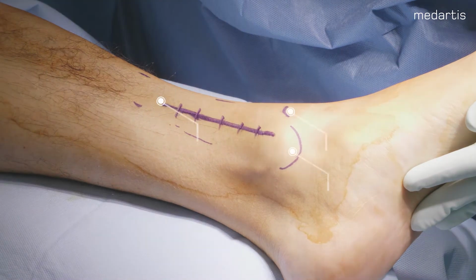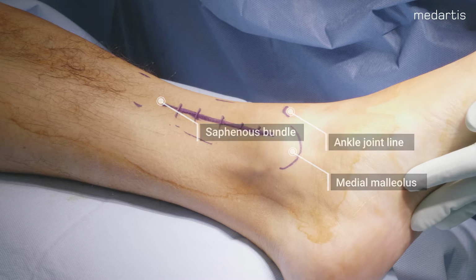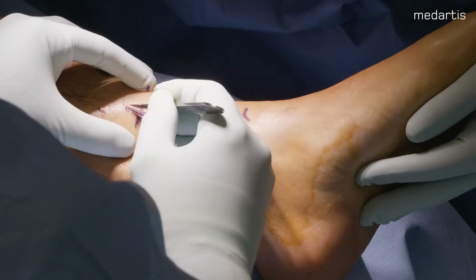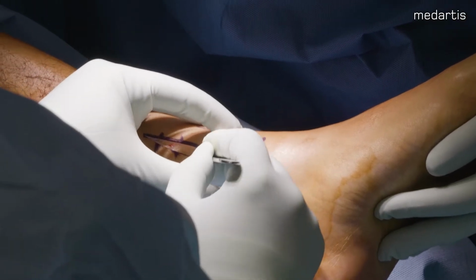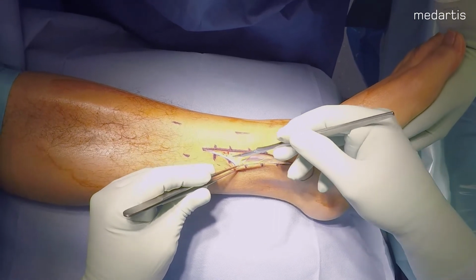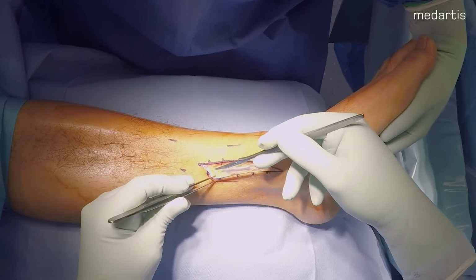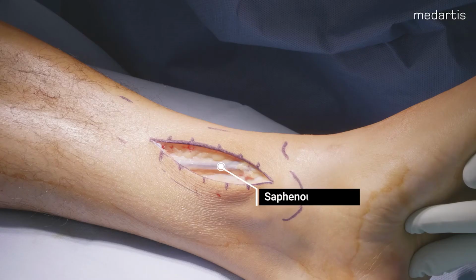Structures at risk during superficial dissection, including the saphenous vein and nerve, are identified and gently retracted anteriorly with a Langenbeck retractor. A sharp incision of the medial distal tibial periosteum is performed in line with the incision. The saphenous bundle can be easily seen.